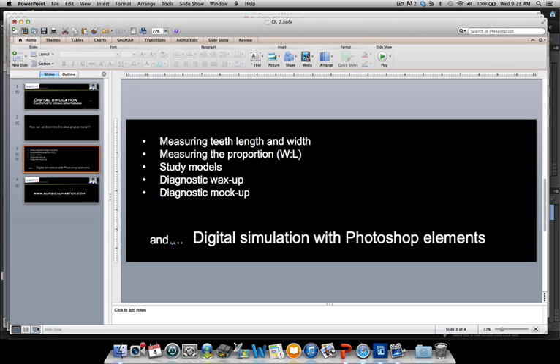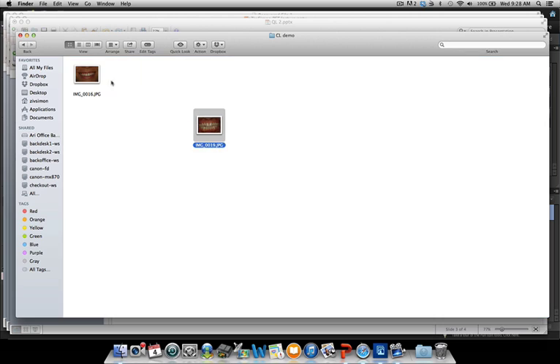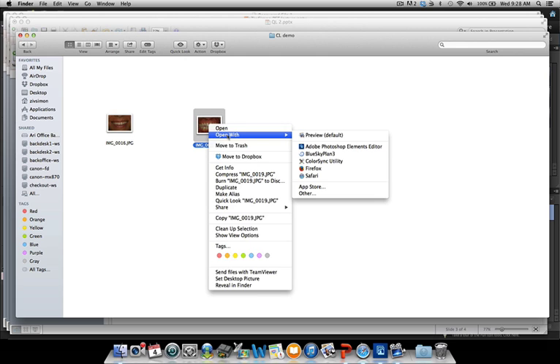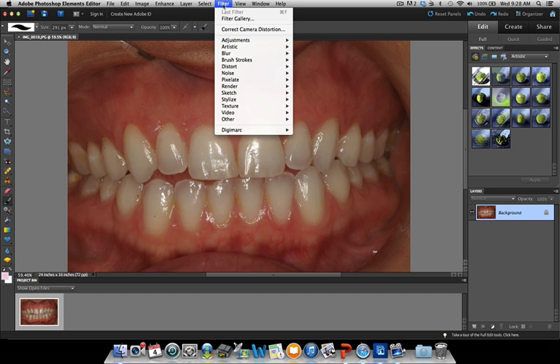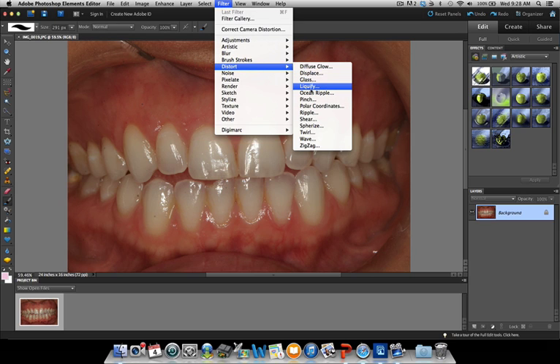There's another step that can help you, and that's called digital simulation. I use Photoshop — specifically the less involved version called Photoshop Elements. It's relatively inexpensive; you can go to Adobe Photoshop and download the software, and you can try it out first to see if it works for you. Let me show you how this works practically. You'll take two photos: one of the patient's smile, and another of the retracted view. Let's start with the retracted view — open it with Adobe Photoshop Elements Editor, then go to the Filter section, choose Distort, and a sub-option called Liquify.